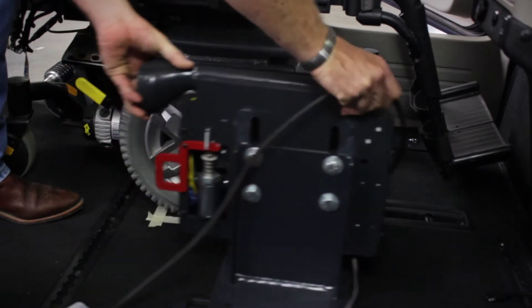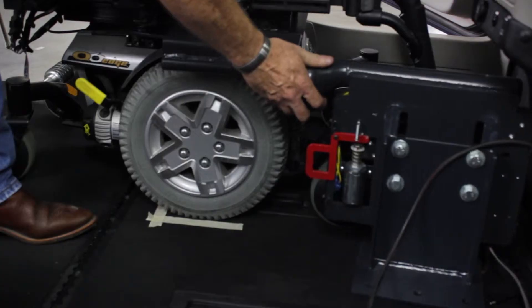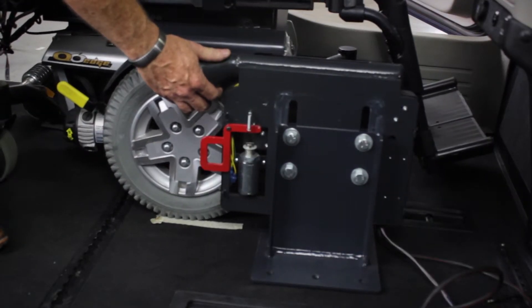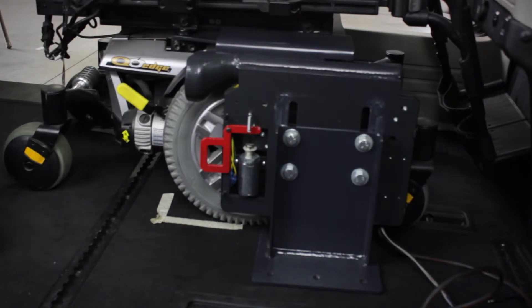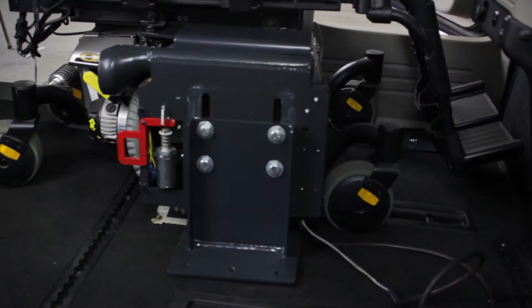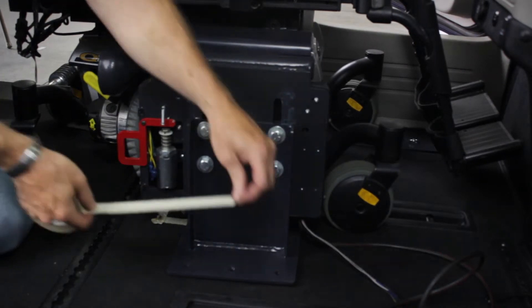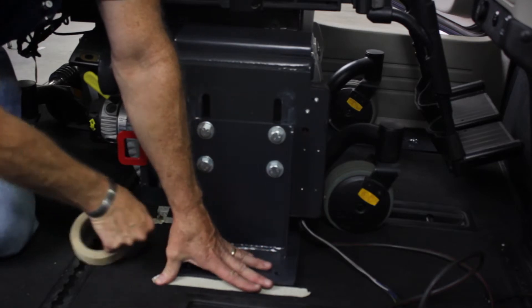Next, place the Hightower unit close to where you will be aligning it with the power wheelchair. Engage the power wheelchair to the Hightower Docking Station, bringing the power wheelchair back to its marked location on the floor. With the power wheelchair and Hightower Docking Station in their proper places, it is time to mark on the floor exactly where the Hightower will be installed.